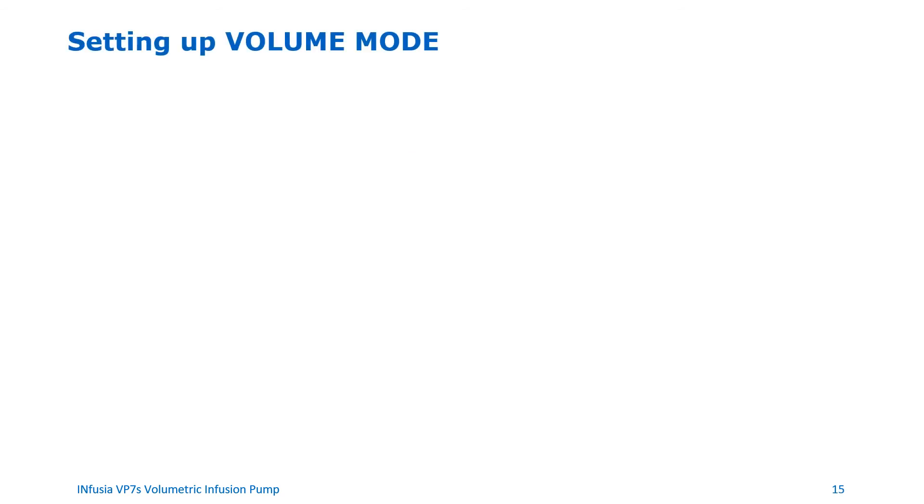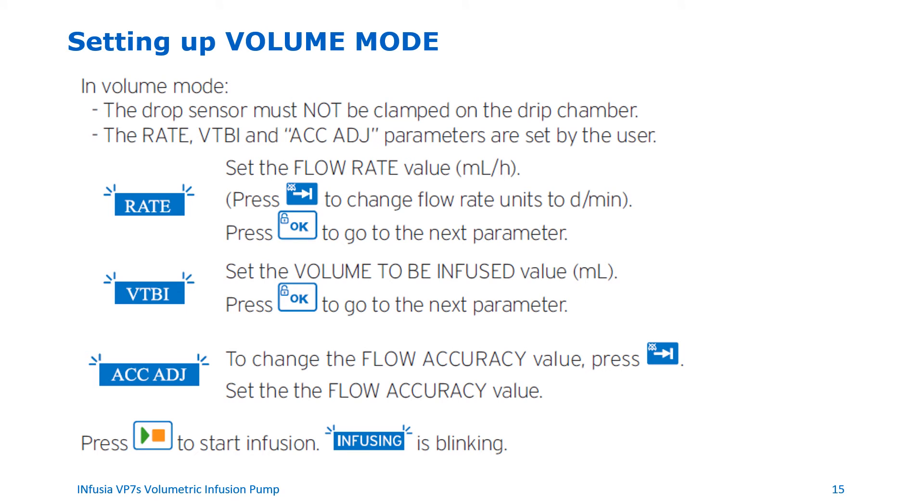Setting up Volume Mode. For Volume Mode to work, the drop sensor must not be clamped on the drip chamber. The user can set the rate, VTBI, and flow accuracy parameters. To set up Volume Mode: set the flow rate value in mL per hour. If you need to change the flow rate units to drops per minute, press the switch button. Press OK to go to the next parameter. Set the volume to be infused in mL, then press OK. To change the flow accuracy value, press the switch button and set the desired value. Press the start/pause button to start the infusion; 'infusing' will blink on the screen.